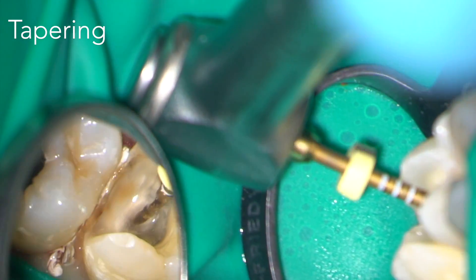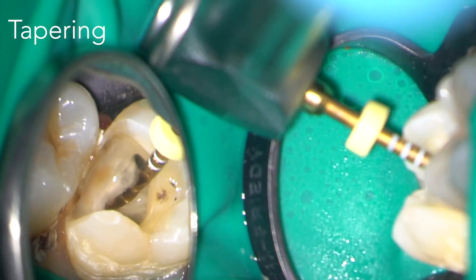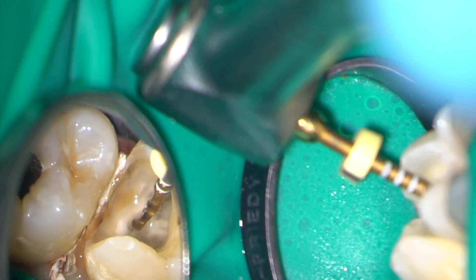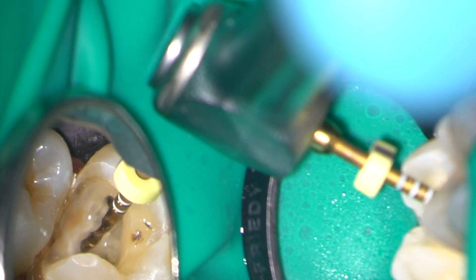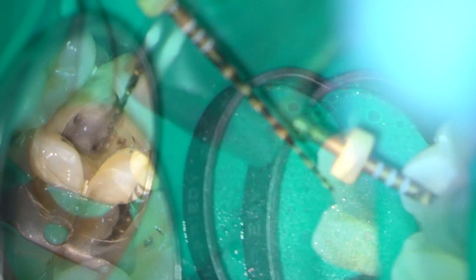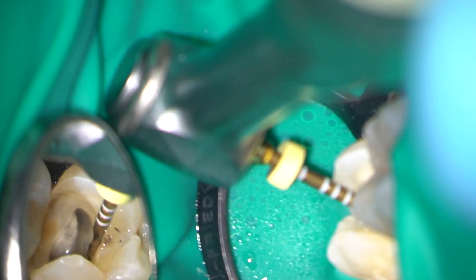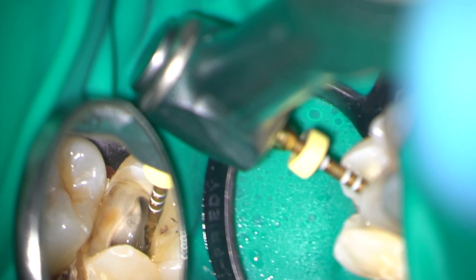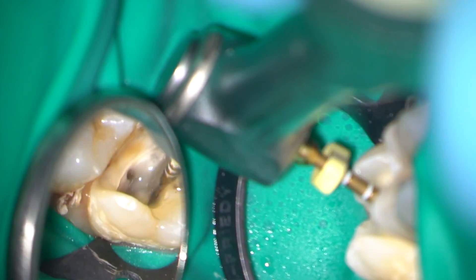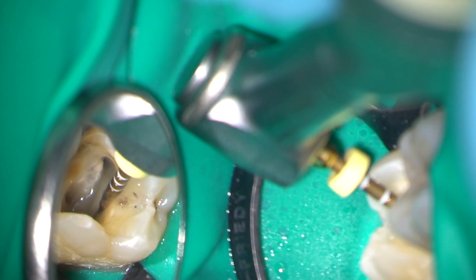It's tempting to let the instrument run all the way to the working length in one hit, but this isn't really advisable. There's a lot of dentine mud being created and it's probably better to do it in stages to avoid extrusion of infected material and a potential flare-up.